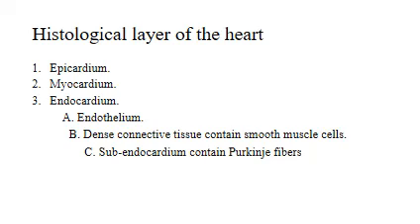As I explained, the histological layers of the heart from outside to inside begin with the epicardium, and it's composed of flattened cells, simple squamous cells resting, of course, on a basement membrane as usual. All the surface epithelial cells are resting on a basement membrane, and this is the layer of the epicardium, and it's equivalent to the visceral layer of the serous pericardium.